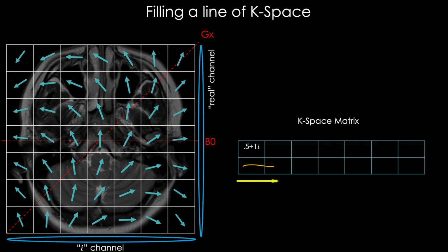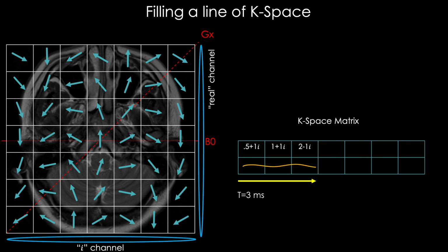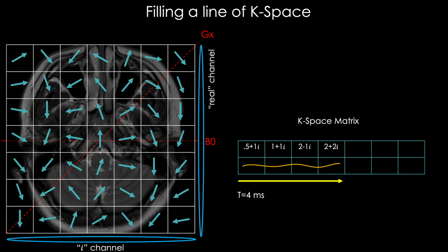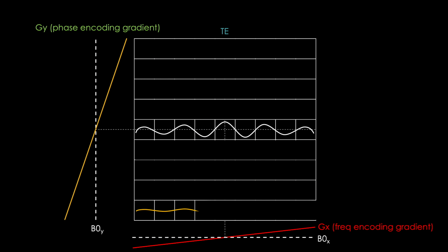You can see visually this gets pretty hard to follow as we now dephase across the x-axis, ultimately generating the following, placed here at the bottom of this picture. Notice how much weaker this echo is than before, because not only did we cause more dephasing with this GY gradient, we chose a very strong and/or lengthy gradient, causing the maximum amount of dephasing we want to achieve.